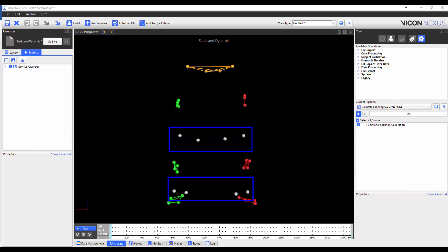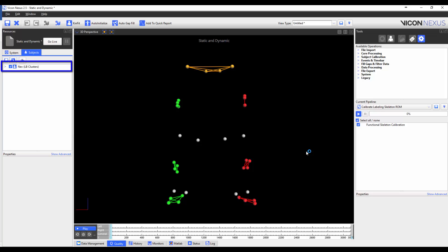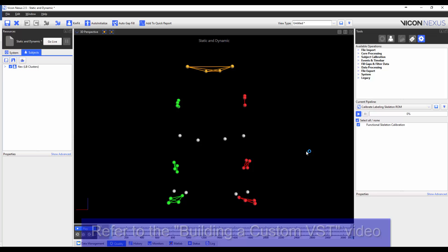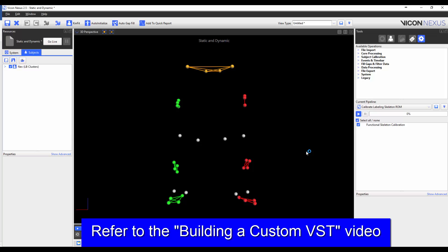You will notice that the knee and ankle joint markers aren't labeled, as these were calibration-only markers. This is okay, as they were physically removed from the subject and aren't in any dynamic trials, and they've also been removed from the VSK. I'm now going to go through the trial and make sure that my markers are properly labeled — if markers switch, I switch them back; if markers become unlabeled, I label them properly. However, I do not gap fill. This is the exact same procedure that we used in the building a custom VST video.